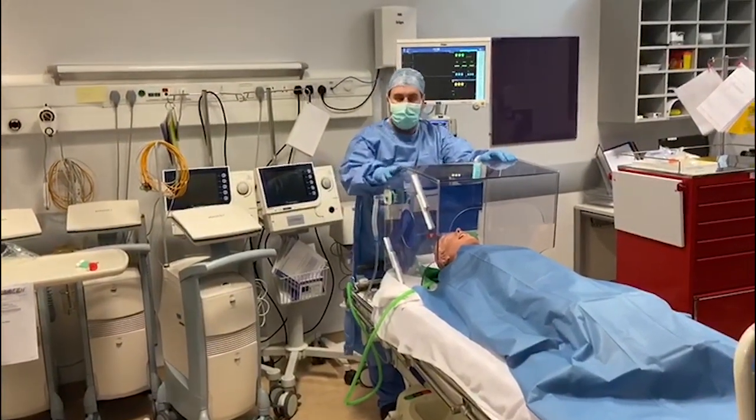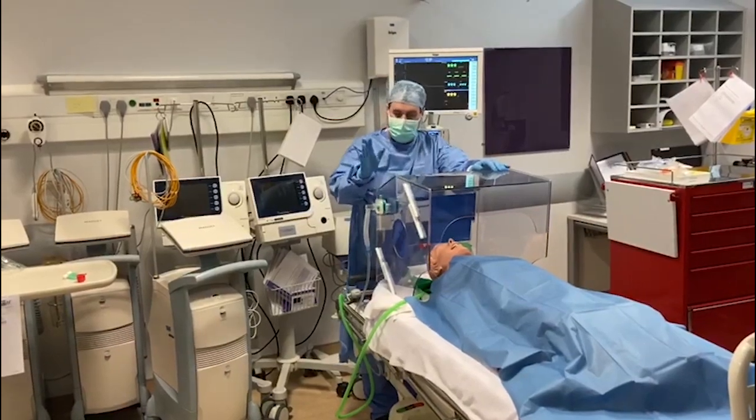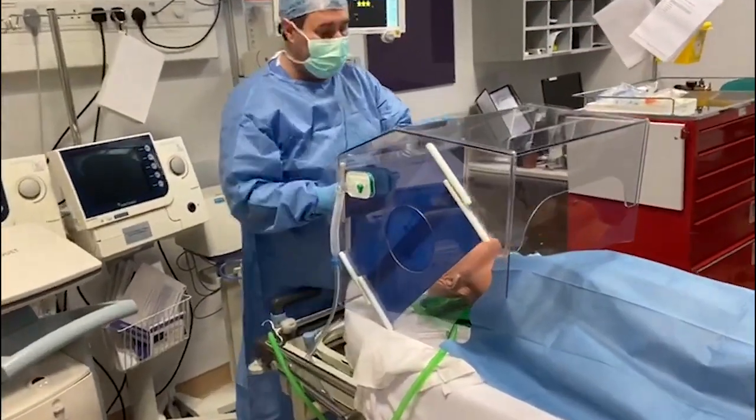This is the UL version of the aerosol box that started in Taiwan. We've made some very important changes. We've just redesigned the shape so we've got a little bit more ergonomics.